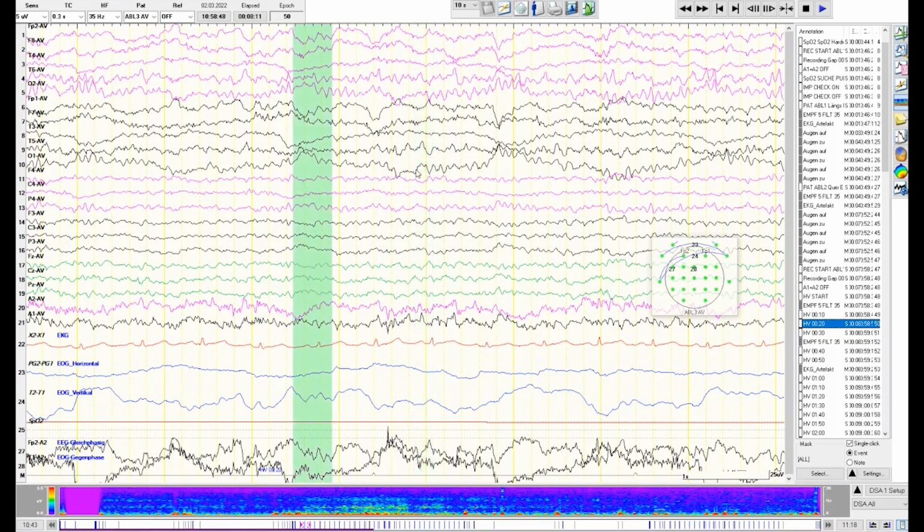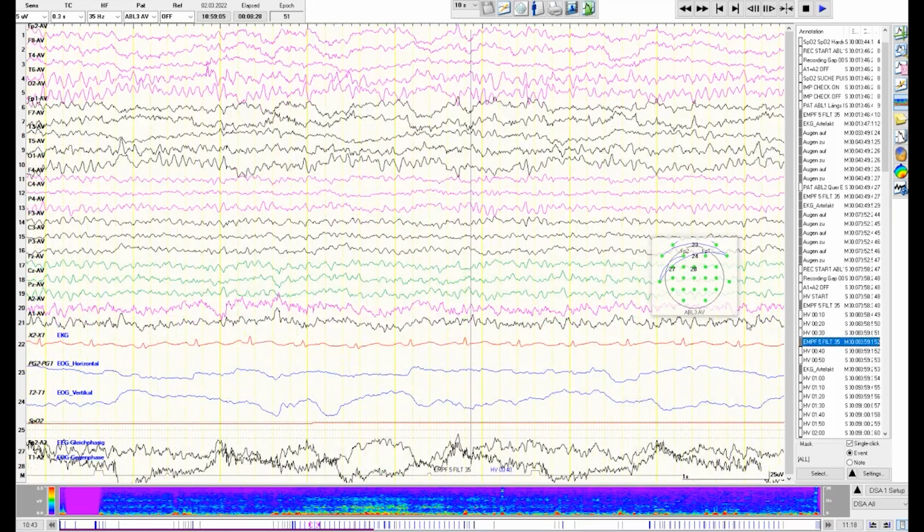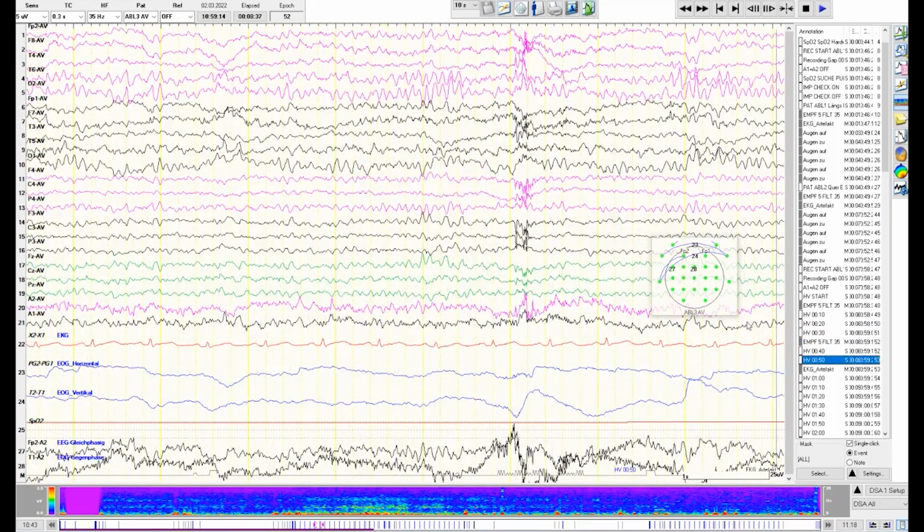This is not very pronounced, but we see that with hyperventilation in the occipital cortex, this slowing is more pronounced. You can see nicely here that although there is a slowing in the temporal occipital lobes, other regions of the brain are still working. So this is a clear sign that this is not vigilance decay, but that the brain in some parts has a slowing where in others it has not. This is a so-called focal slowing that we should write in our report in the end.